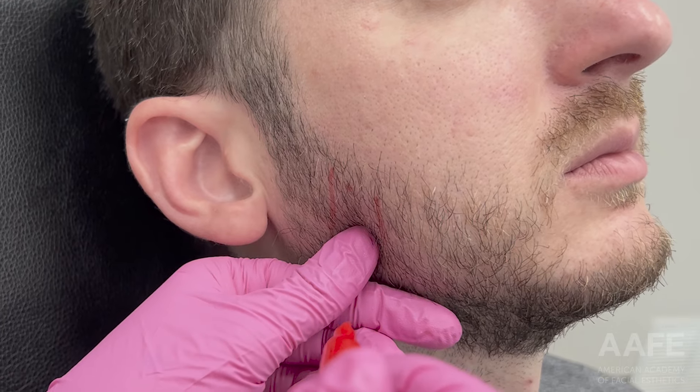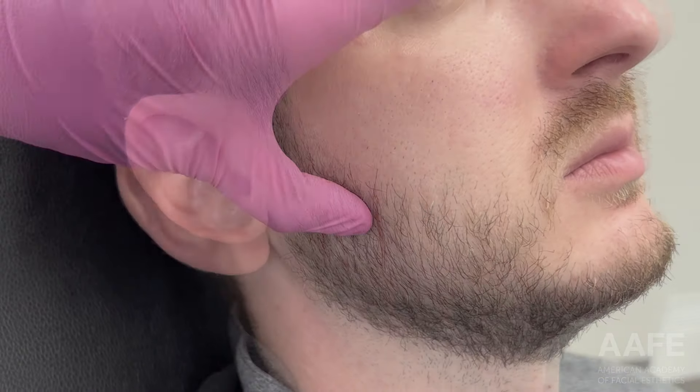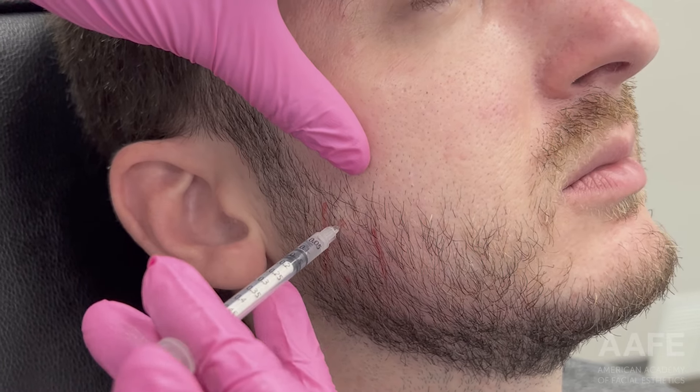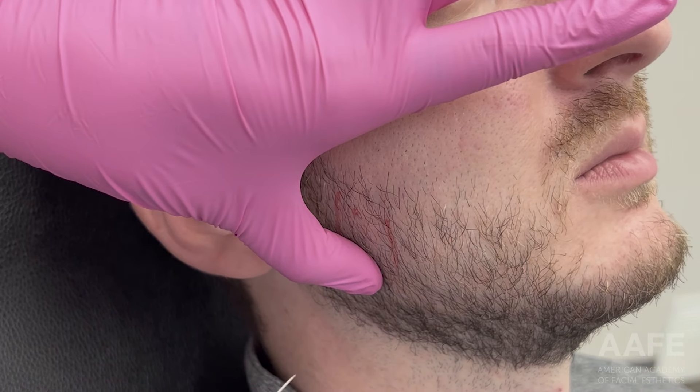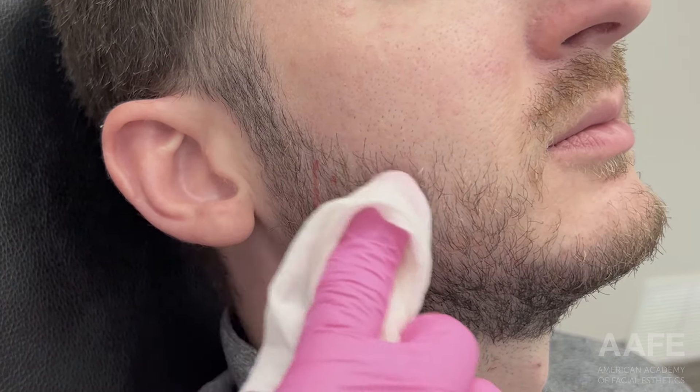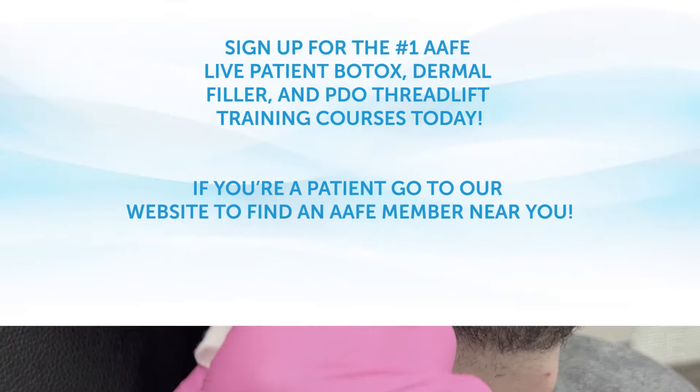Here I'm confirming placement before injecting — injecting at 90 degrees, full needle depth, because the masseter is a deep and very large muscle. After injecting, make sure you clean off your patient and educate them about post-care instructions.